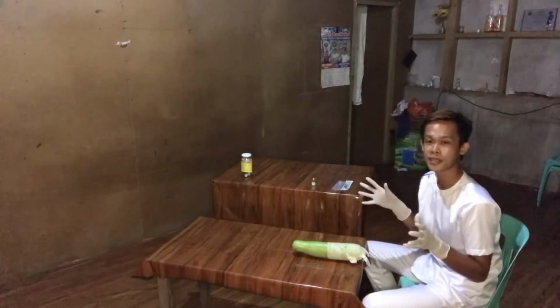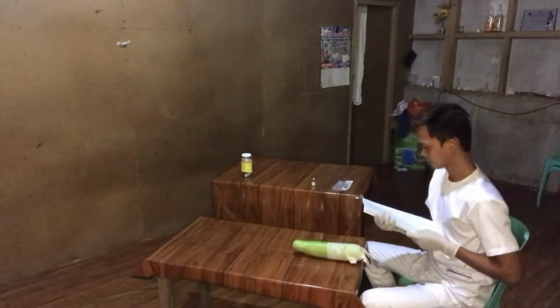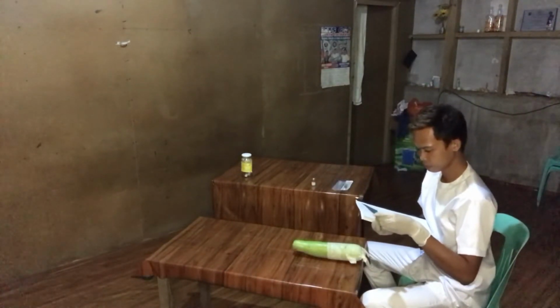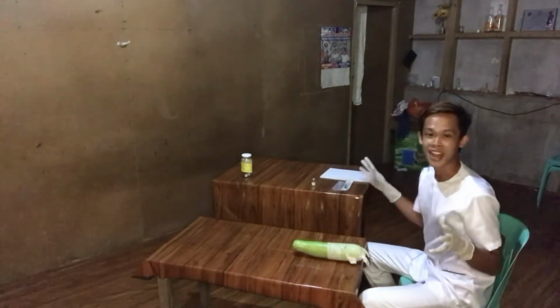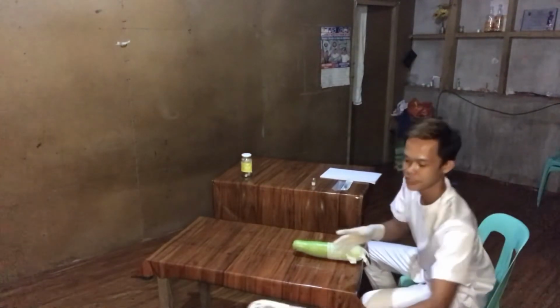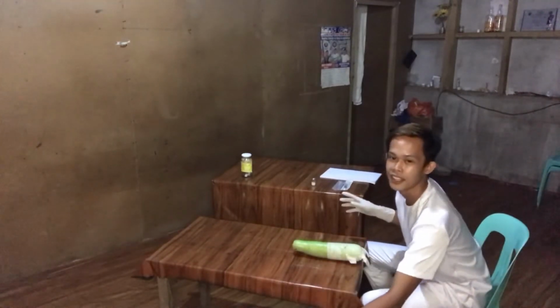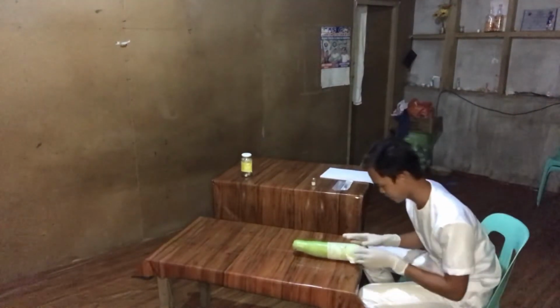First, check the medication order on the patient chart. After that, arrange the medication on a hypodermic tray. This is the arrangement of the equipment that we need. Then choose an injection site free of lesions and discolorations.